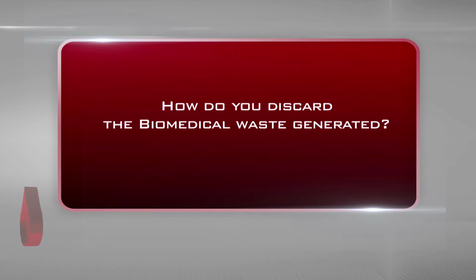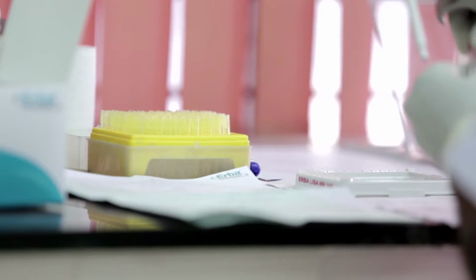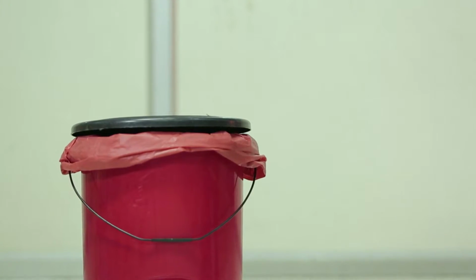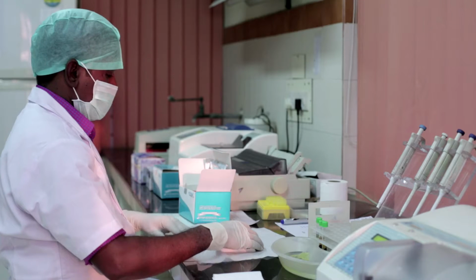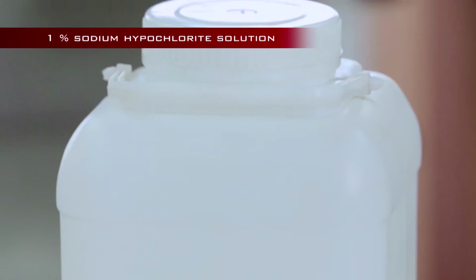How do you discard the biomedical waste generated? After the test is over, discard the tips and microplate in the red biohazard container. All the infected surfaces are cleaned with 1% sodium hypochlorite solution. If there are blood spills, clean them with 1% sodium hypochlorite solution.